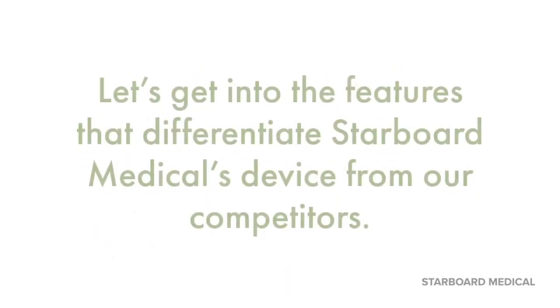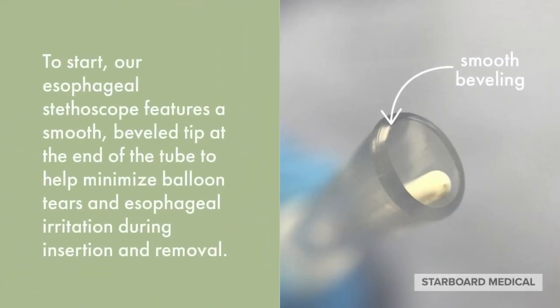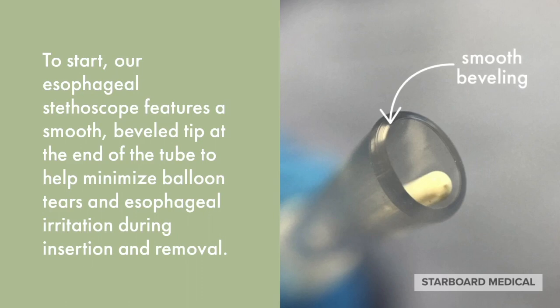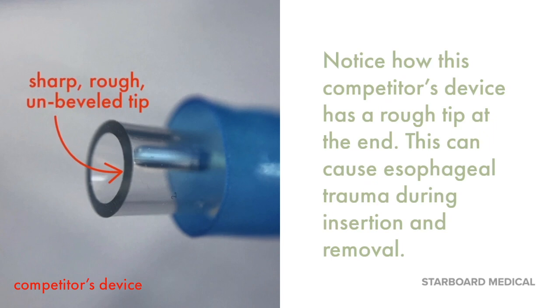Let's get into the features that differentiate Starboard Medical's device from our competitors'. To start, our esophageal stethoscope features a smooth, beveled tip at the end of the tube to help minimize balloon tears and esophageal irritation during insertion and removal. Notice how this competitor's device has a rough tip at the end. This can cause esophageal trauma during insertion and removal.